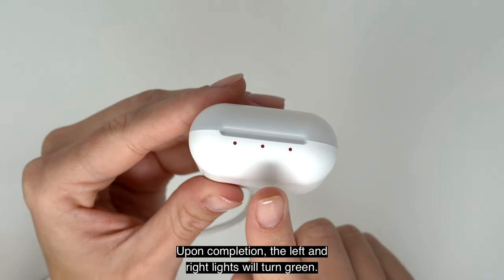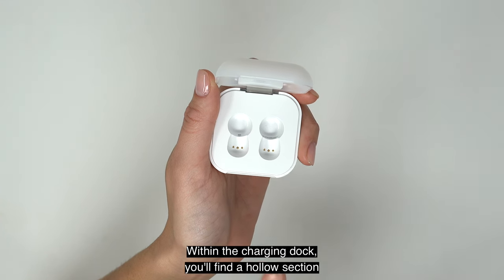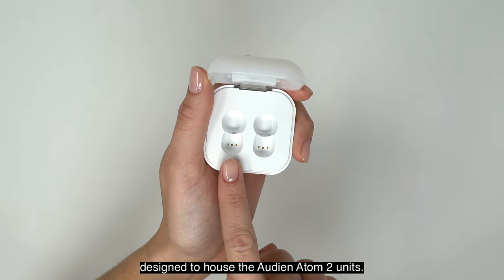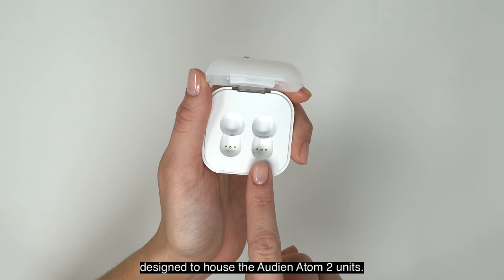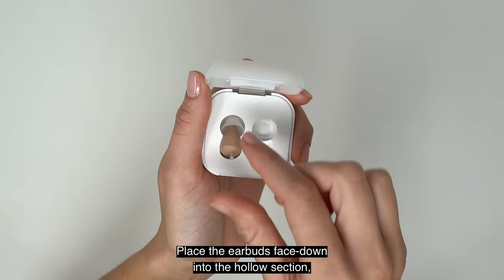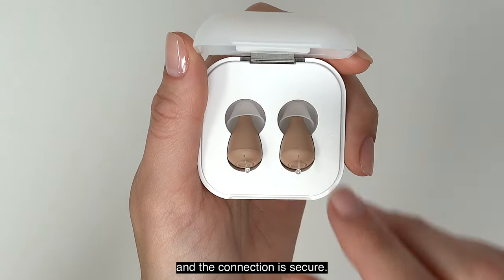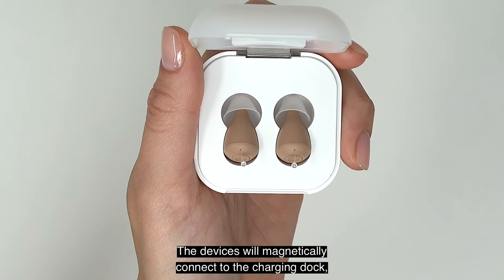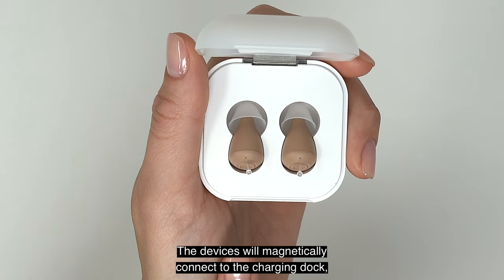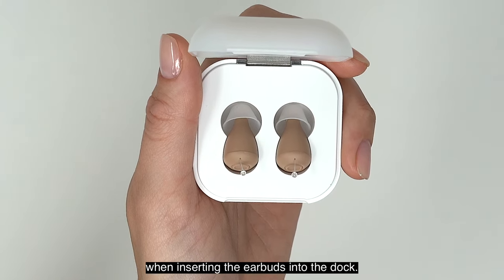Upon completion, the left and right lights will turn green, charging your Atom 2s. Within the charging dock, you'll find a hollow section designed to house the Audion Atom 2 units. Place the earbuds face down into the hollow section, ensuring the removal wires are not bent and the connection is secure. The devices will magnetically connect to the charging dock, and you should feel them click into place.